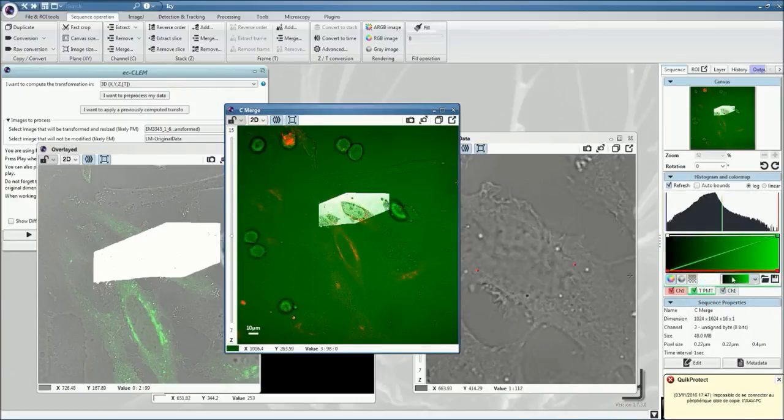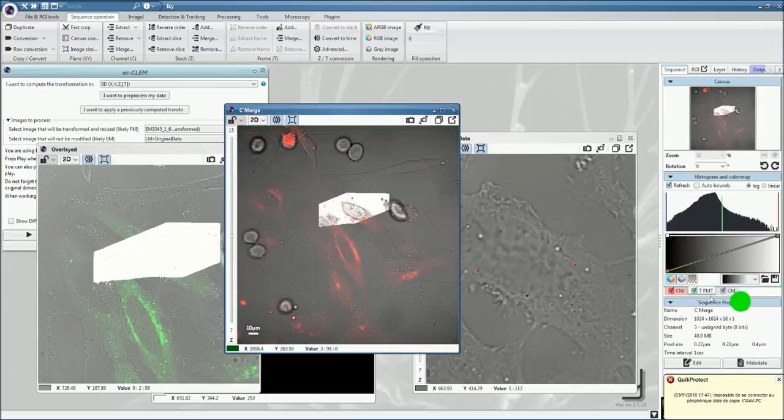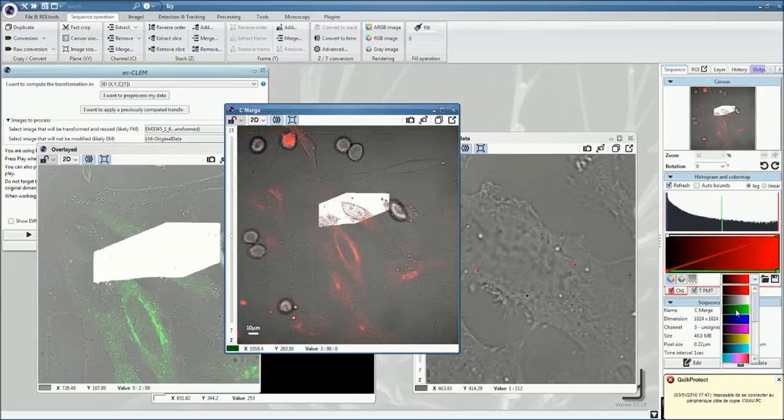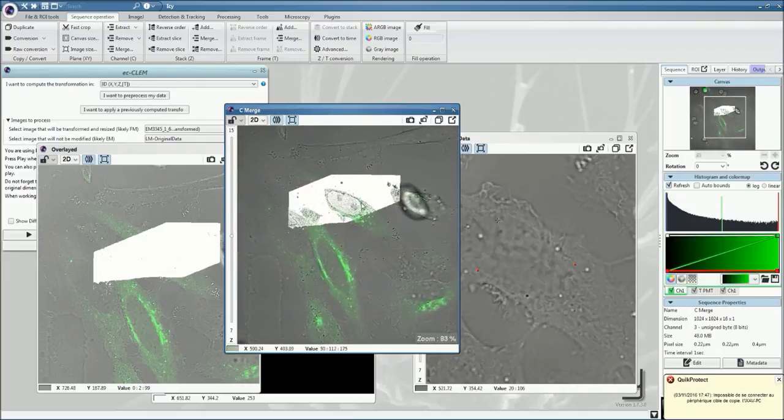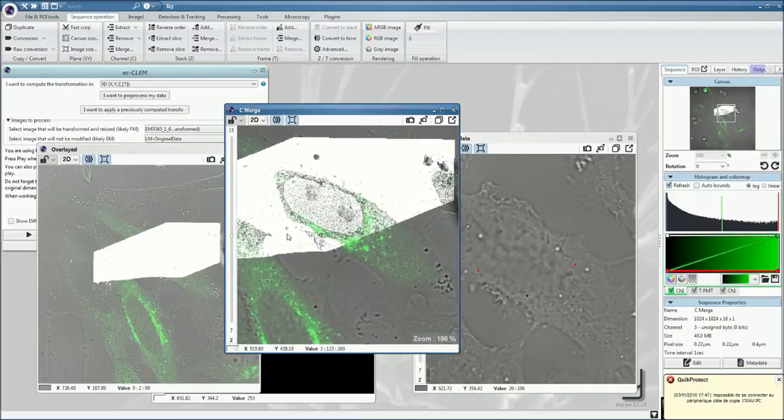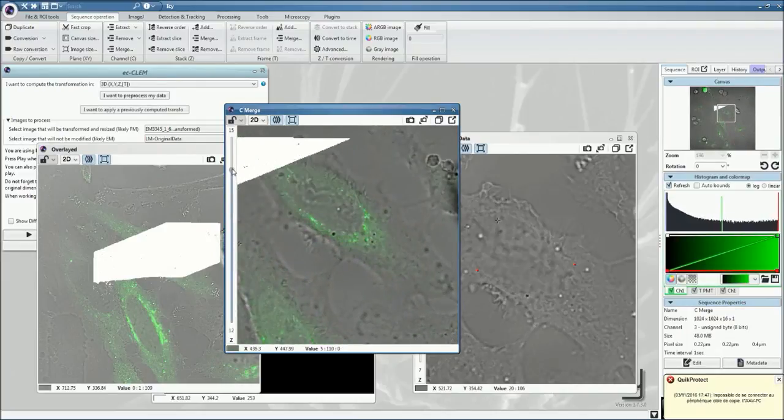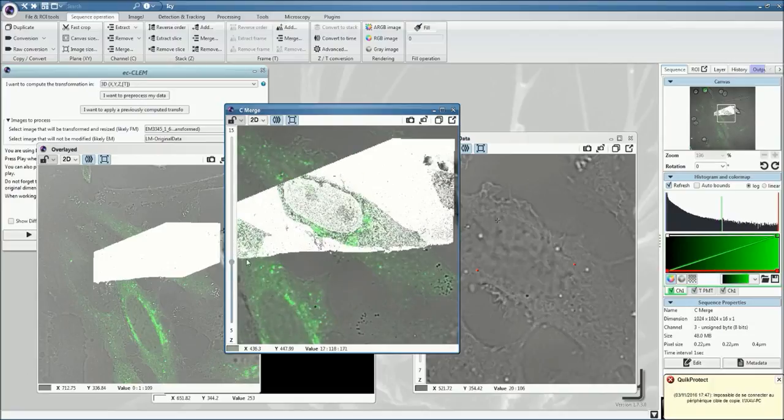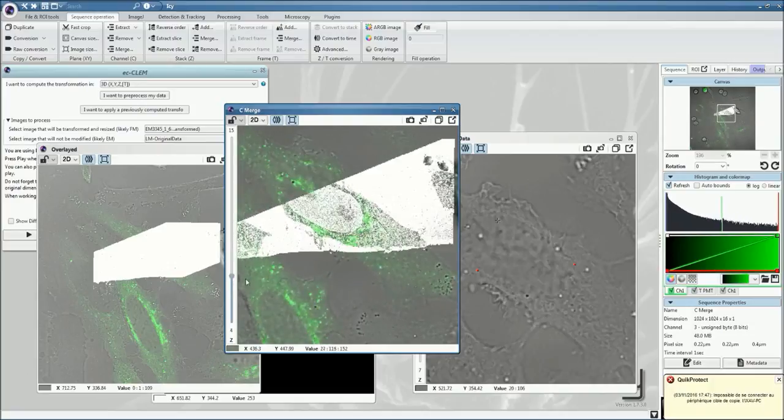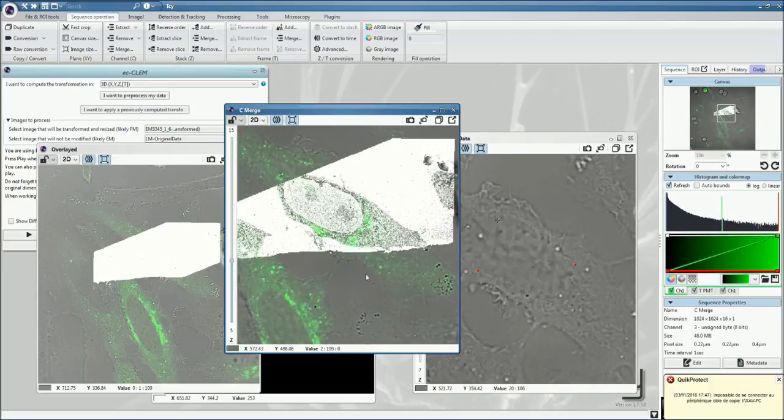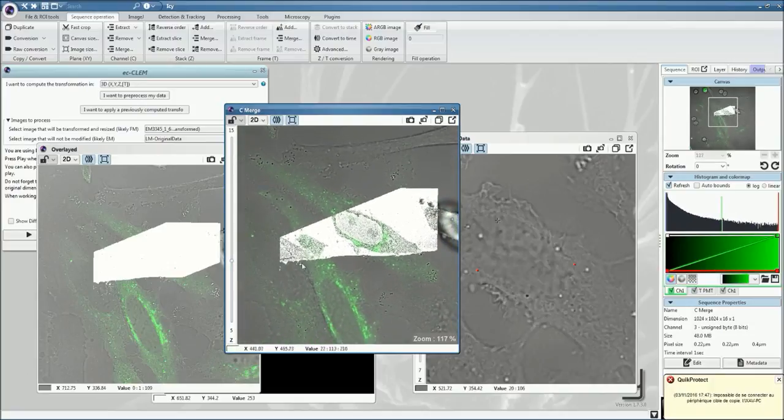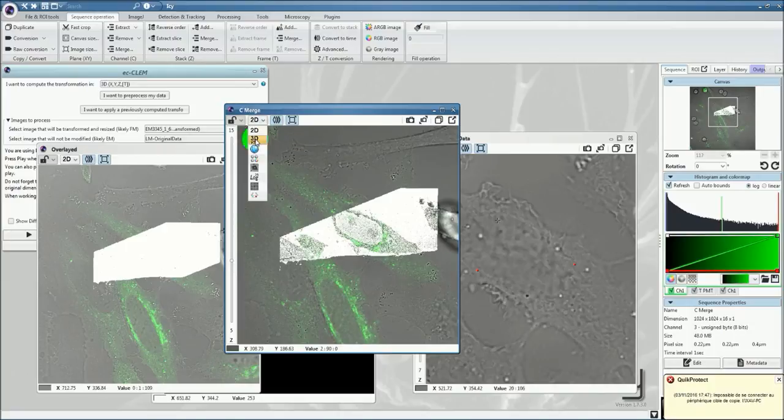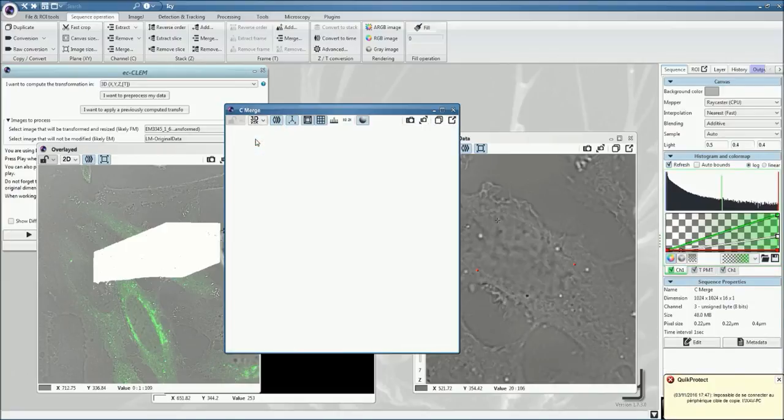Now, if you adjust the channels in a more familiar way, here this would be transmitted light, and channel one would be the fluorescence, in our case it was green before. Now we can already see that the fluorescence is spanning accurately.